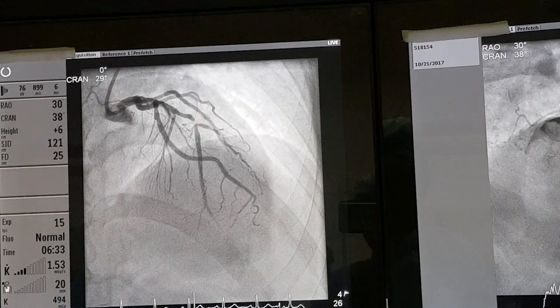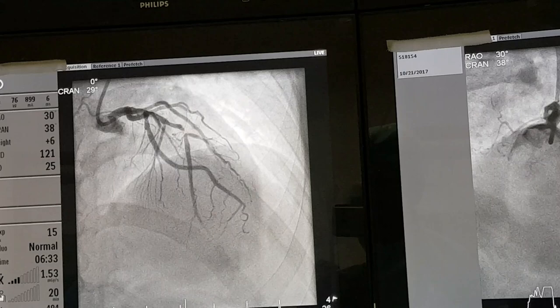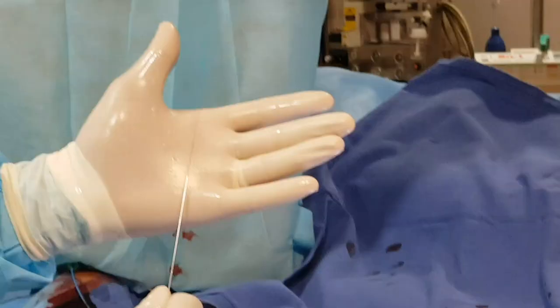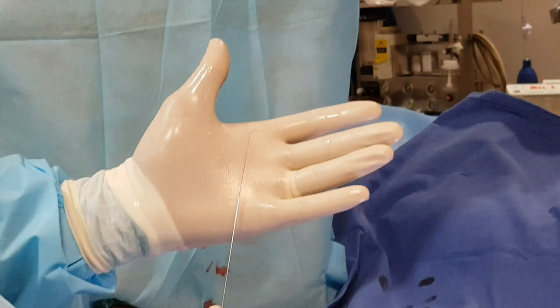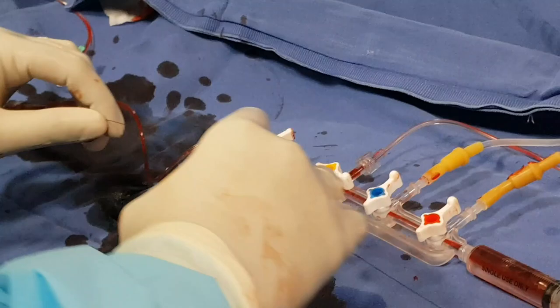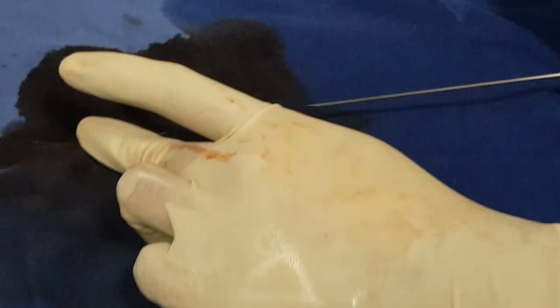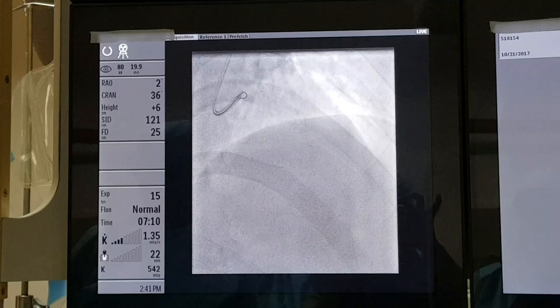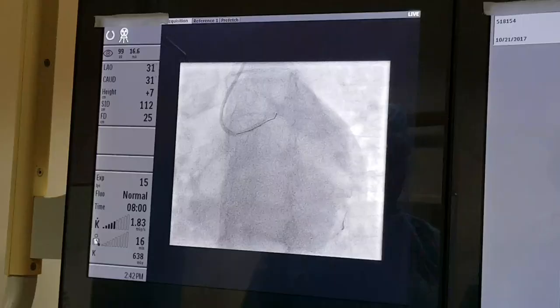So now what I am going to do is pass a wire through the block, then put a balloon and dilate it, and then place a stent. This is the coronary wire which we are going to pass into the coronary artery. I put it into the guiding catheter hub and advance the wire; then I remove the introducer. Now the wire is in the guiding catheter and I will slowly push it into the coronary artery.